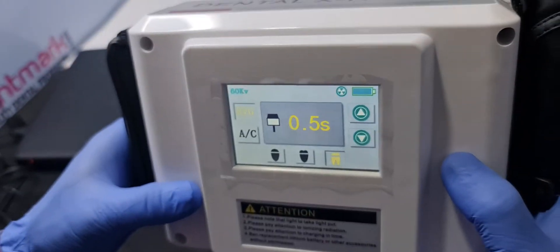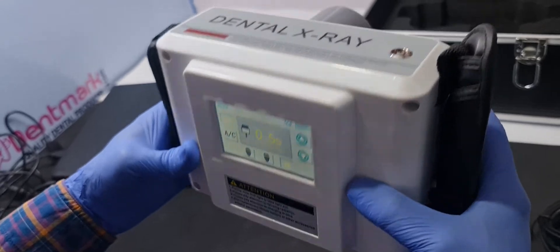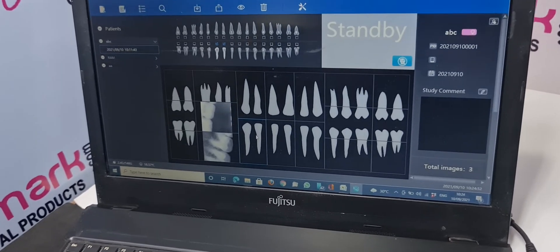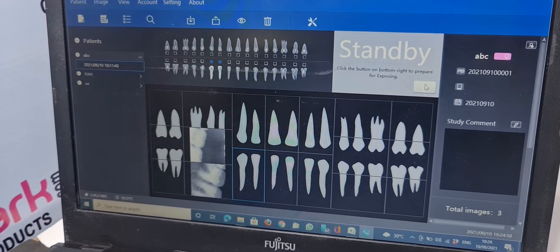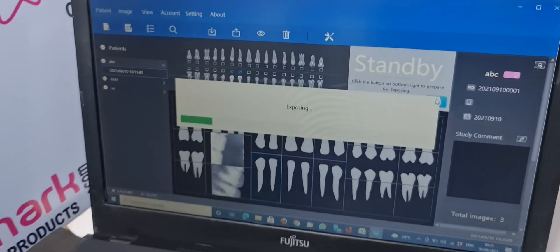Now I will give you the demo with the RVG sensor. I am going to demonstrate on the second and third teeth of anterior. Select this position and press this button — click the button to prepare for exposing.